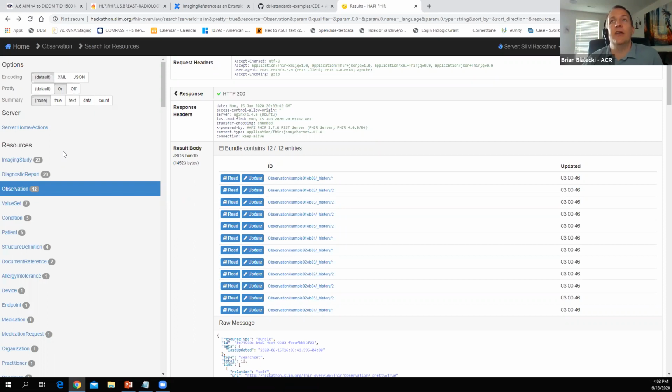You know, obviously I could call the image itself, or I could call GSPS objects, or secondary captures, or key images, things like that. But I could never actually tell you there's a line from this pixel to this pixel on the image that I brought up, and that's the exact line that I'm talking about. And I think that's the difference when I'm trying to embed this through FHIR, and it helps me be a little more specific than I can in the DICOM world.